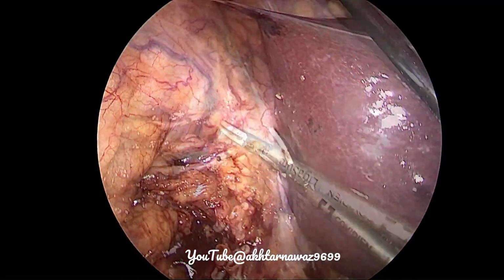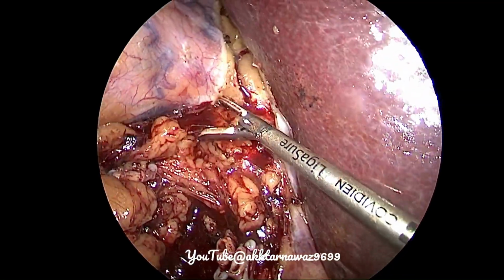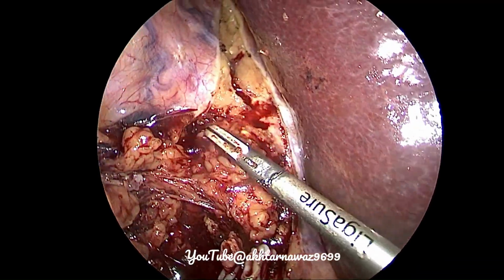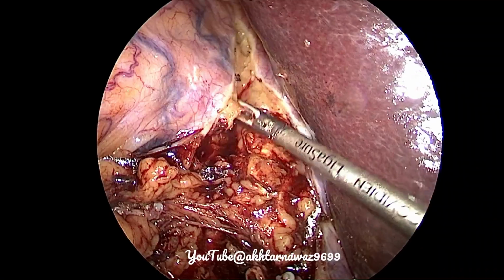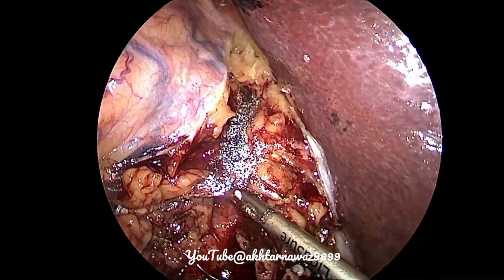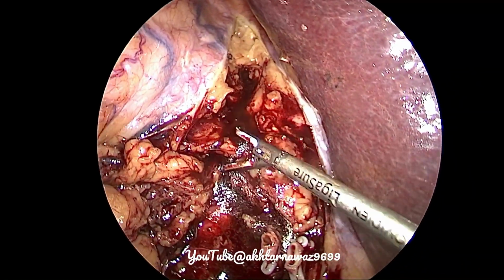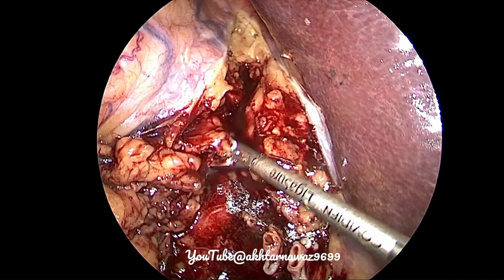Always remember to dissect and cut in a horizontal rather than vertical portion. There are small vessels, especially veins, exchanging between the upper pole of the kidney and the adrenal gland.